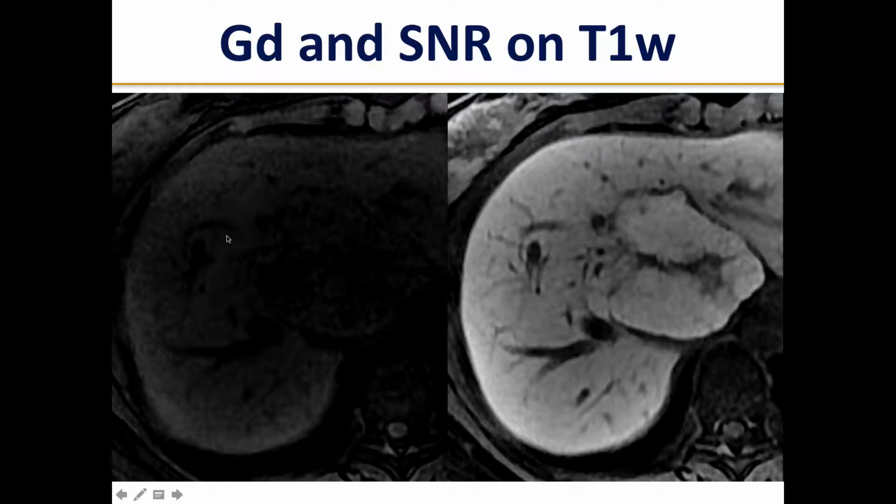So you can see that pre-gadolinium, there's so little signal coming from the liver that with this particular window level setting, you can barely see the liver. Same exact window level setting, now look how bright the liver is. Now for extra credit, I'll just ask a rhetorical question.